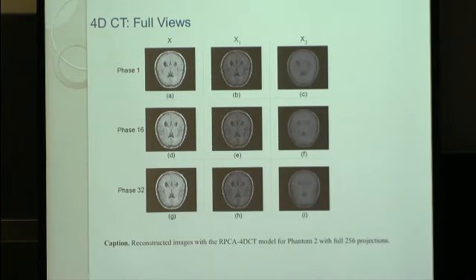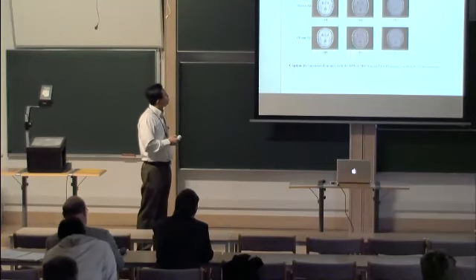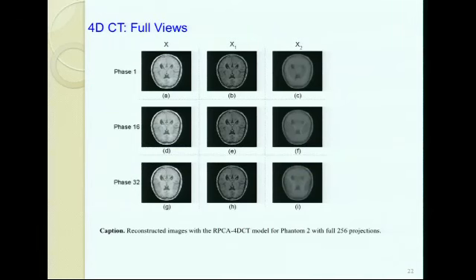Although CT helps radiology therapy, the radiation dose is almost 40% of the whole dose you use for this therapy. So it's very important to reduce the dose. So here, hopefully, we can see using the dynamic scanning procedure, you can see almost as clear as the full measurement, but the dose is equivalent to the partial views.